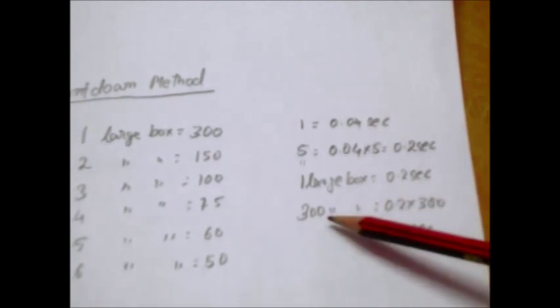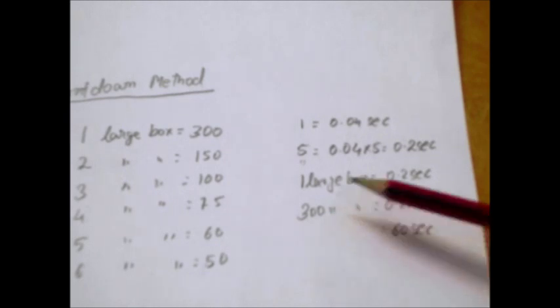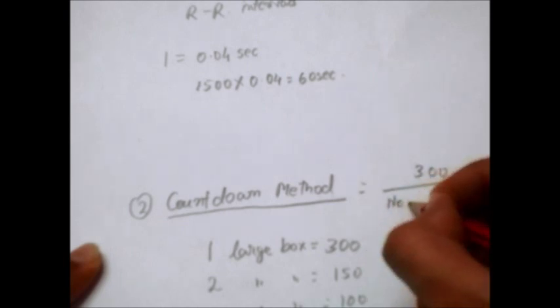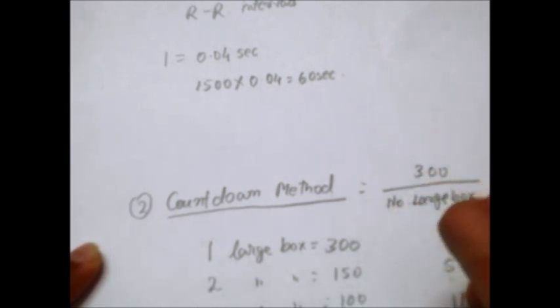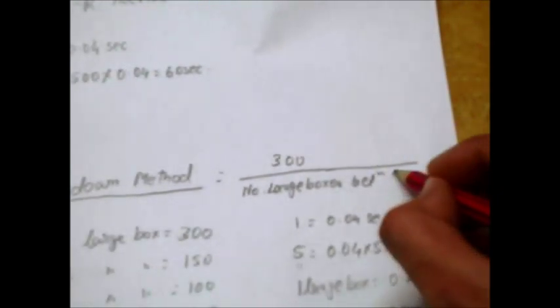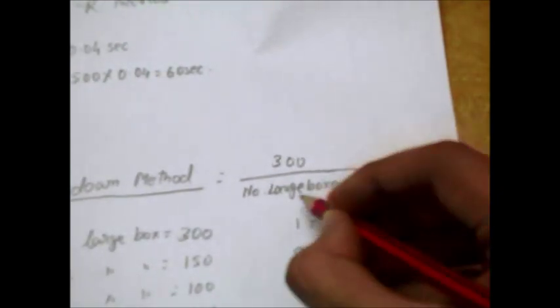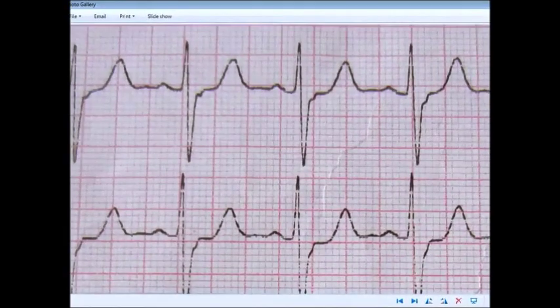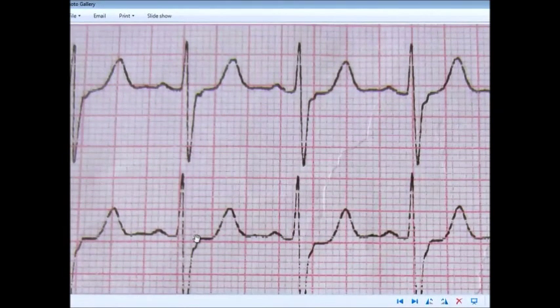Now if you divide number of large boxes by 300, that is 300 divided by number of large boxes between two consecutive RR intervals. I hope you understood that.